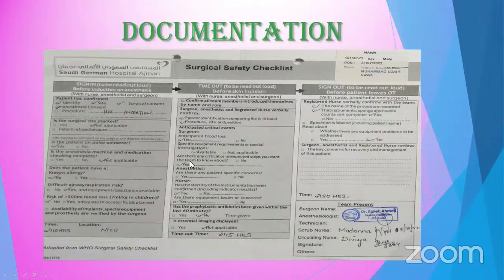We will take CBC, RFT, then blood culture. Critical anesthesia, not applicable also. Has sterility of the instrumentation been confirmed? Yes. Are there equipment issues or concerns? Yes. Did the baby receive antibiotics before? No. Essential imaging not applicable. And then date and time.